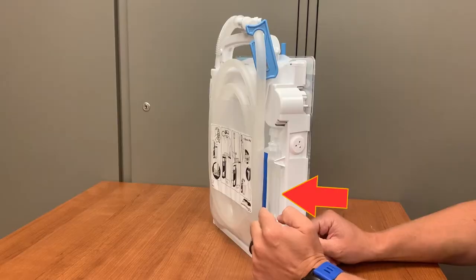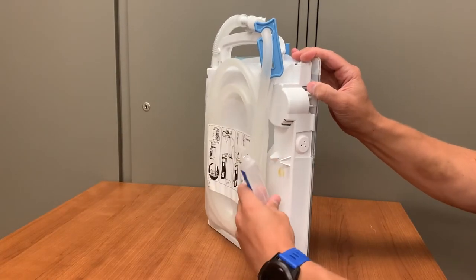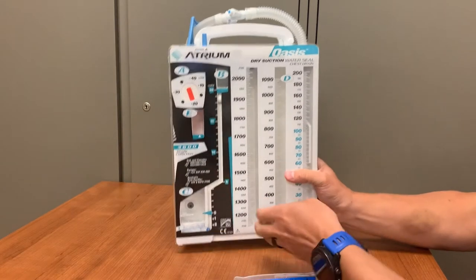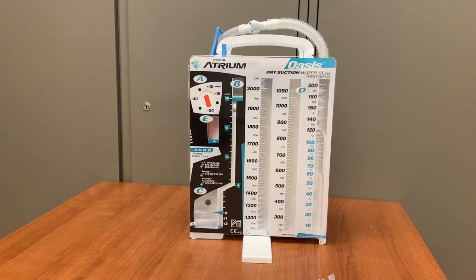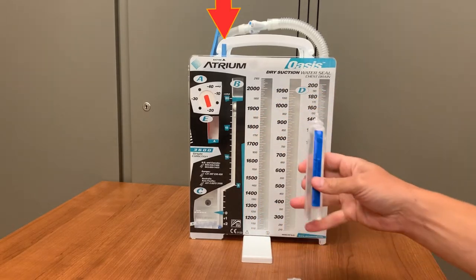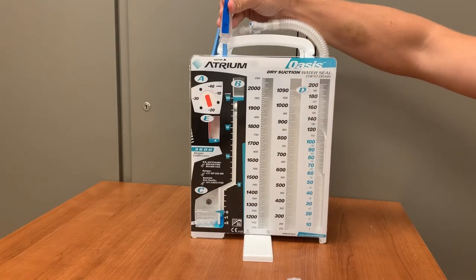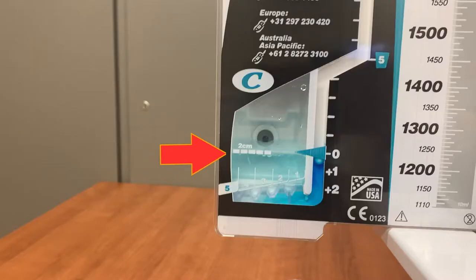Also on the back, a small container of sterile water is attached to the system. Remove the water, then place the drainage system on a stable surface. Anytime the Oasis system will be resting on a surface, utilize the attached stand. Spin the stand, which is attached to the base of the unit, out to stabilize the container. It's important that this container never get knocked over or tipped. Insert the sterile water into the blue port on the top of the Oasis and empty all the sterile water in. There is a blue dye in the chamber that will color this water. When it is filled, the water should reach the two centimeter indicator line.